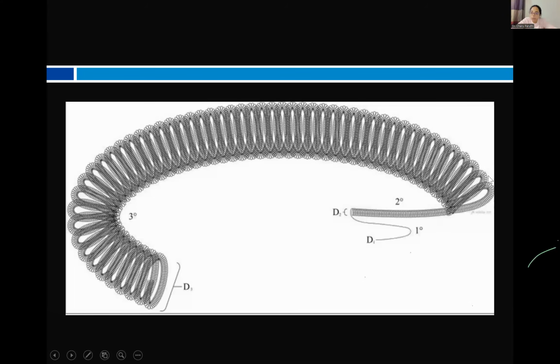So the length of this wire is actually the length of the coil. It is not the length of the coil when it's coiled on itself, but the length when it is stretched into this secondary structure. The diameter of this secondary structure can be either 018 or 035, and this directs the size of the catheter through which this coil can pass. If it's an 018 coil, it will pass through a smaller catheter. If it's a 035 coil, it will pass through a larger catheter.